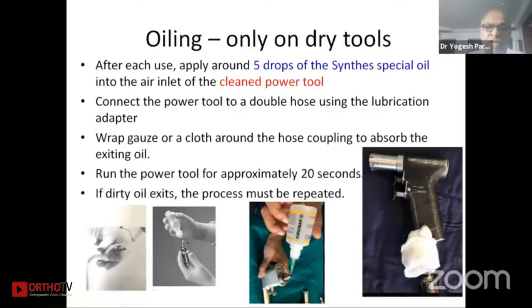Oiling is very important to keep the machines in good condition, and oiling should be done only on dry tools. If there is any moisture on the drill or any parts you should not oil it — it will make a paste and allow germs. After each use, apply around five drops of Synthes special oil into the air inlet of the clean power tool. Connect the power to the double hose using a lubrication adapter, wrap gauze or cloth around the hose coupling to absorb exiting oil, and run the drill for a few seconds so all internal debris comes out onto the gauze.